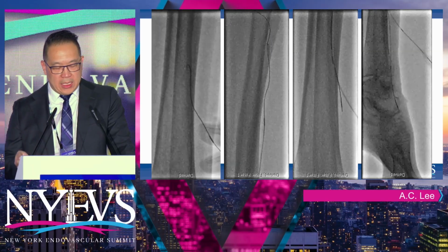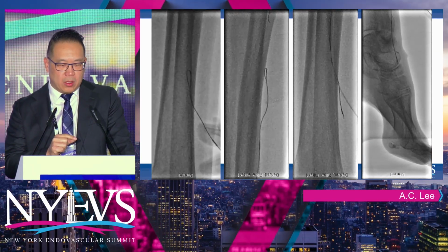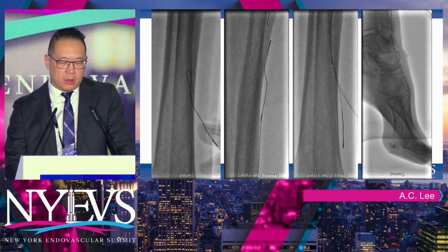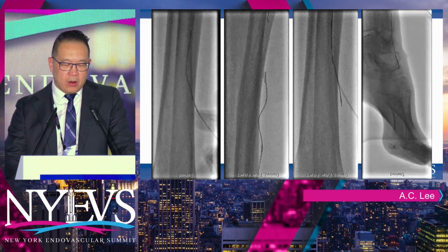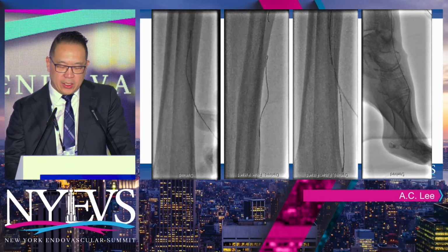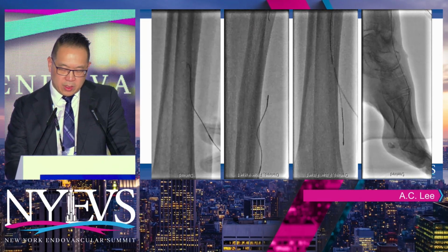Once I put it into the artery, I switch to fluoro, and I try to keep the loop very, very small, with the 018 catheter right behind it, to make a loop similar to what I do in the SFA on a larger scale. So we get up to the point where the artery is open in the proximal tibial vessel, reverse the wire, bring it down, and then continue going forward in the chronic total occlusion in the anterior tibial artery.